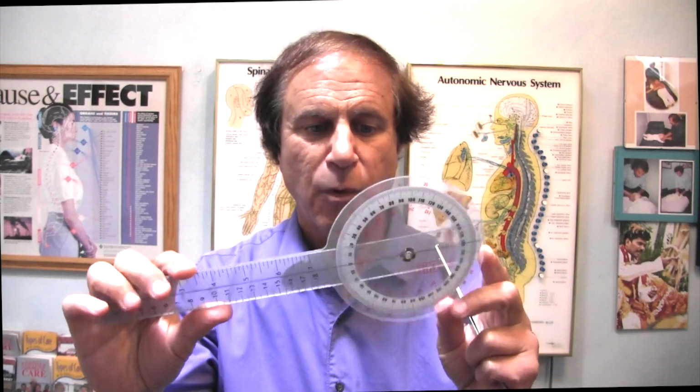What I'm going to show you are the basics of how to use a goniometer. A goniometer is a fancy name for a device that helps measure the angles of degree, the amount of movement that patients go through during range of motion testing. That's what they're primarily used for.